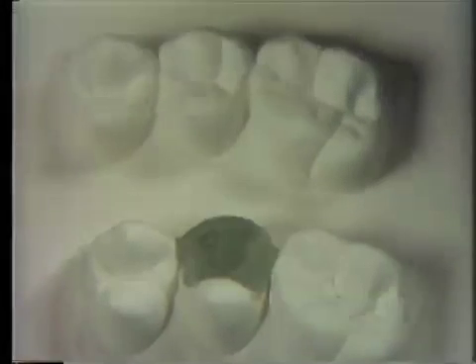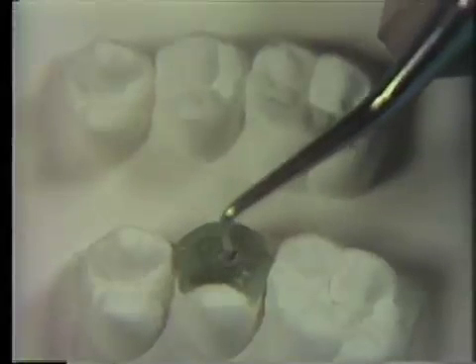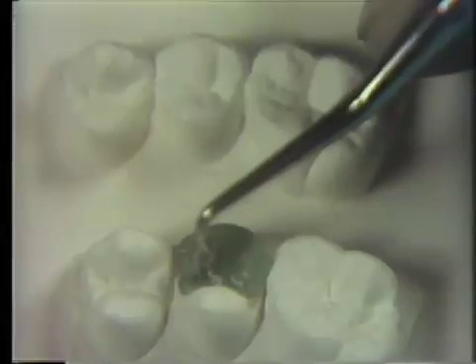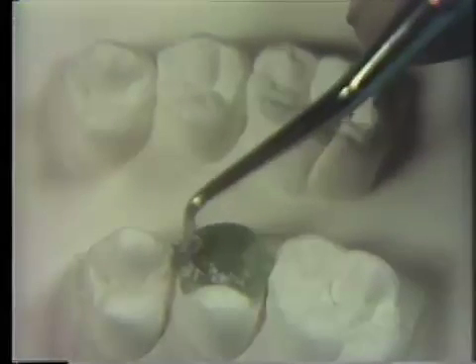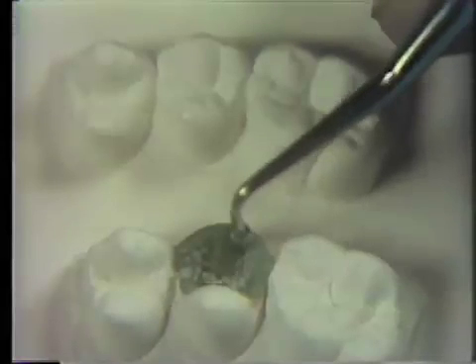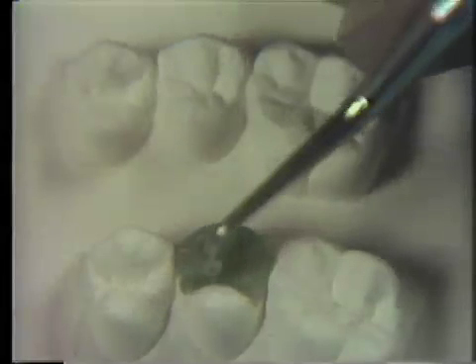Brush away the wax chips with the stiff bristles on the larger end of the whip mix palette brush and zinc stearate. The wax adding portion is now complete. Now define the occlusal fissures with the PKT number 3. Force the instrument through the wax in the precise direction that the fissure takes as in the replica above. Also concentrate on simulating an appropriate depth of fissure at this time. Brush away the wax chips with zinc stearate. Repeat the fissure carving as necessary.